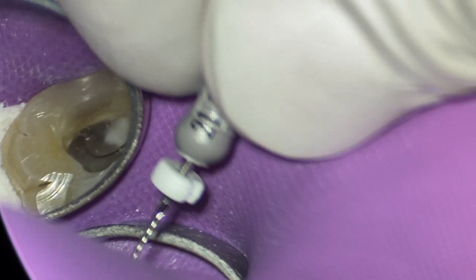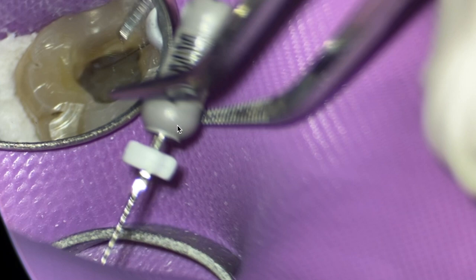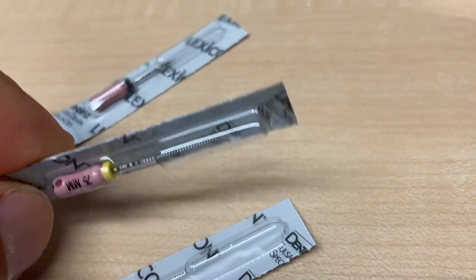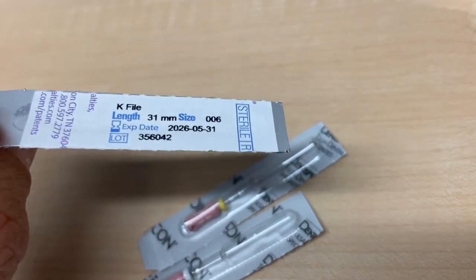But then when I go to take my file and try to put it in there, I've got a small bend on the apical portion of my file, it won't go. So what I'm going to do, maybe there's some debris in the way, so I'll get some liquid, maybe I'll use sodium hypochloride to get some irrigant down there. I'm trying to get that file to go into that little spot. That's an orifice filled with debris, there's a little divot there. I should be able to get that file in there, but it wouldn't go. So I'm like, okay, fair enough. So I struggle with that for a little bit.